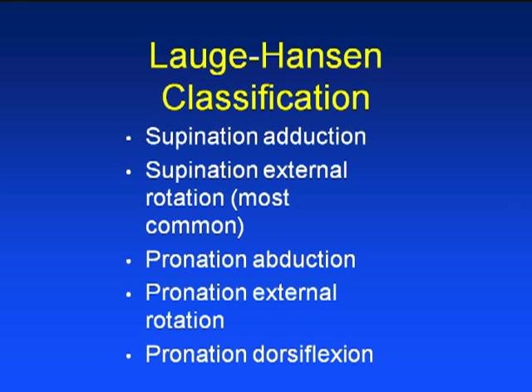And that Weber classification sure is seeming easier because I can say A, B, or C. And I'll tell you, in regular practice, I don't use this classification in terms of speaking unless it's one of a couple that kind of stand out. I will give all of the pertinent information so that an orthopedic surgeon could read the body of my report, and make up their own mind, and with a high likelihood, come up with the same classification that we would come to if we were looking at it together.